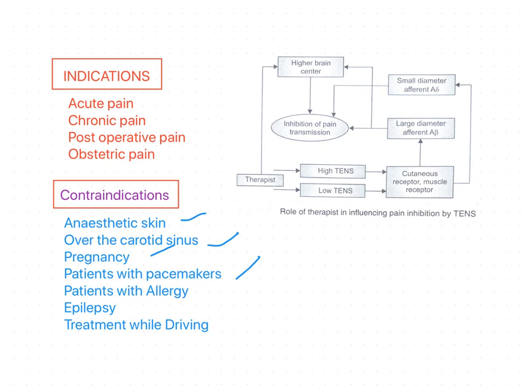And patients with allergy: if the patient has an allergic reaction to the electrode gel or tape that persists at the time of treatment, TENS should not be applied with these materials. In the case of epilepsy, patients who have epilepsy should be treated at the discretion of their clinician.